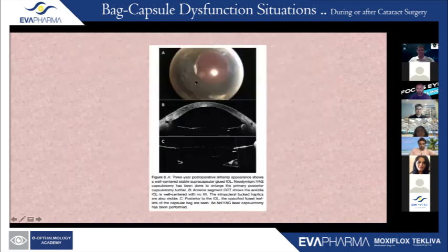And this is the 3-year postoperative appearance of the same child. We can see a well-centered, stable supracapsular glued IOL. And we did an Nd:YAG laser posterior capsulotomy later to enlarge the PCCC further. This is the anterior segment OCT of the child. You can see those haptics tucked in within the sclera, a very well-centered and stable aniridia IOL with no tilt. And you can also see here those leaflets, which are the posteriorly fused leaflets of the intact capsule, with the YAG also having been done.